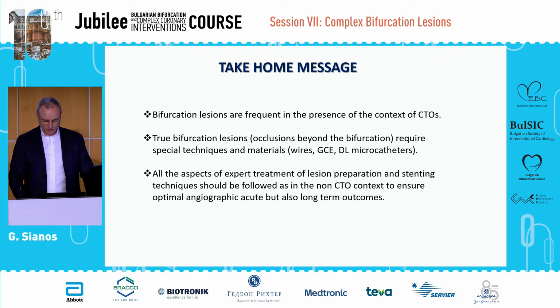True bifurcation lesions, and occlusion beyond the bifurcation, require special techniques and materials that everybody has to be familiar with. On top of all of this, I think that expert lesion preparation and stenting technique should be followed as in the non-CTO context to ensure optimal angiographic acute, but also long-term outcomes for these bifurcations. Thank you.